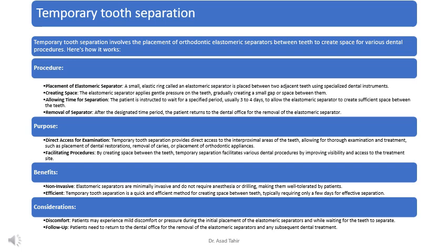Patients may experience mild discomfort or pressure during the initial placement of the elastomeric separators and while waiting for the teeth to separate. Follow-up. Patients need to return to the dental office for the removal of the elastomeric separators and any subsequent dental treatment.